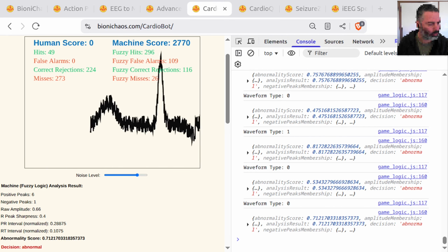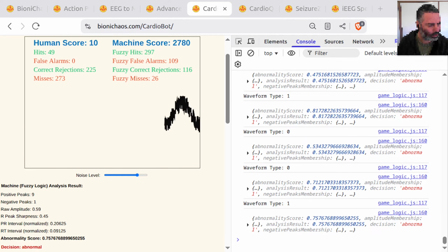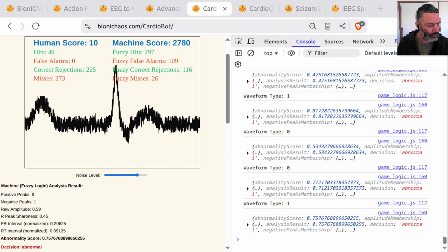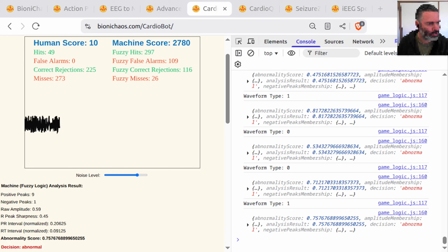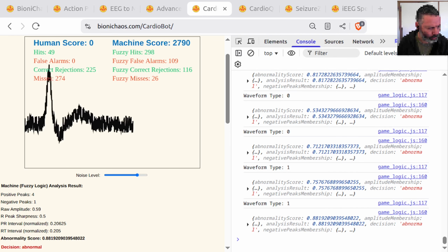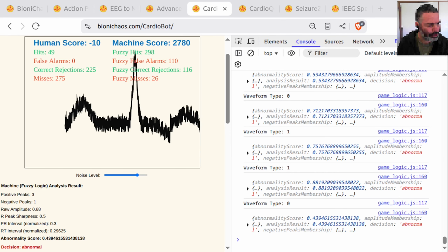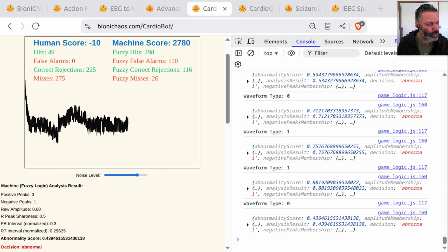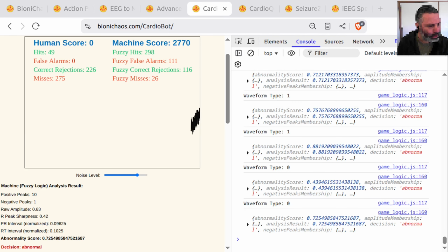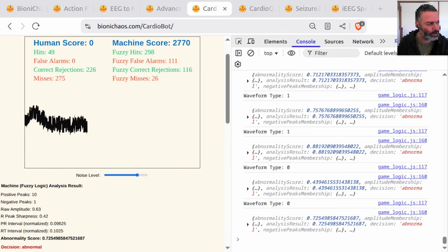This is where the architecture simplifies beautifully. We don't need the massive overhead of scikit-fuzzy. That library is great for complex industrial control systems, but for our simple diagnostic rules, a custom implementation is ideal. We use the KISS principle. Keep it simple, stupid. The fuzzy system is based on simple trapezoidal and triangular functions for membership and a set of explicit if-then rules. Precisely.